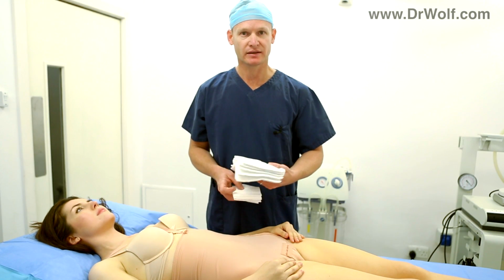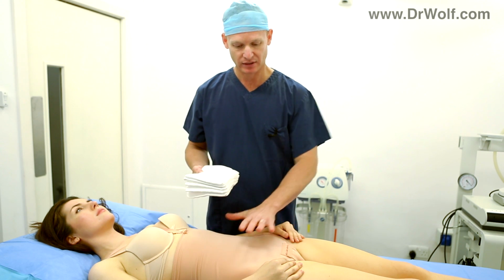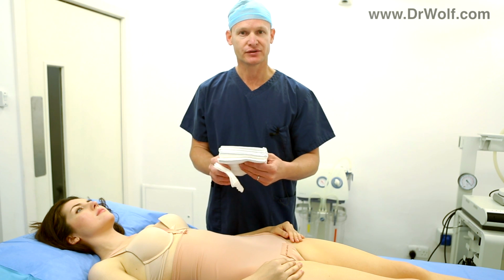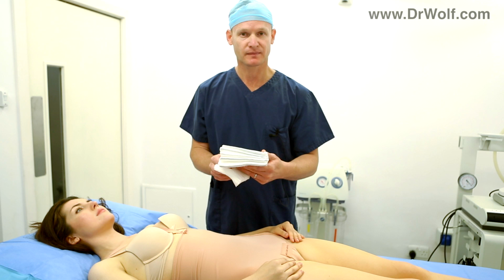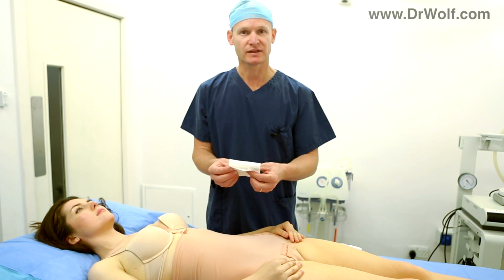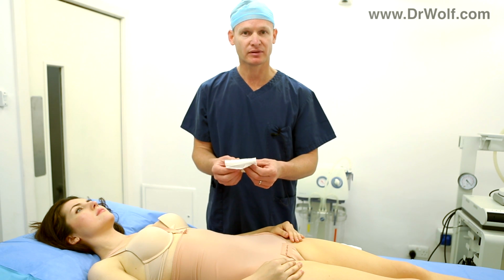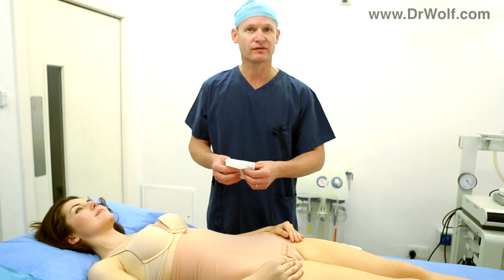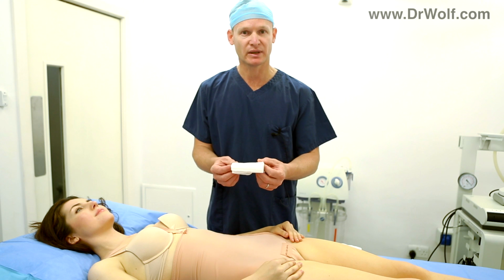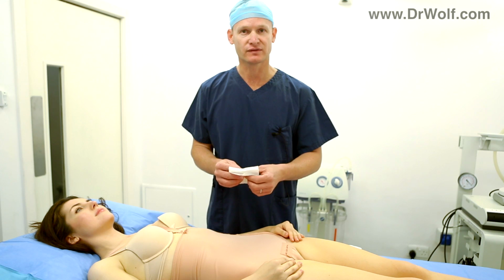So after the treatment, you'll be padded up with very thick pads, usually of this size, all around the tummy, underneath the compression garment, and these will be remaining in place for the first 24 hours, during which the leakage is the most. After that, they can be replaced with these smaller ones. Those will be sufficient for the trickle that will take place from day 2 onwards. So remember that once you leave the clinic, you'll be really padded up, possibly look like Michelin Man, but this is only for the first 24 hours, and after that these can all be replaced by smaller padding which will then absorb all the trickle that will take place. So you'll look fairly normal after the first 24 hours.